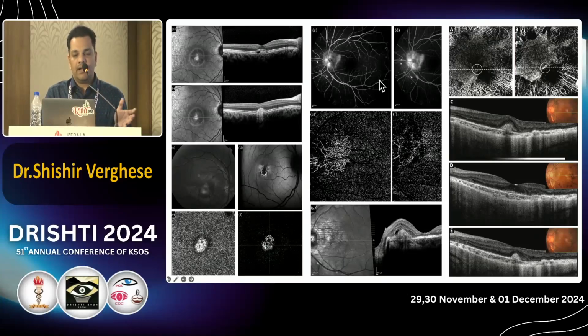Also in inflammatory conditions like VKH, you can have peripapillary CNV. So this is a peripapillary CNV adjacent to the disc, and this is post-treatment. You can see the regression in the network of blood vessels. So this is another CNV seen in a choroideremia patient, which was post-treatment. It had crumpled and become like a fibrotic scar there.